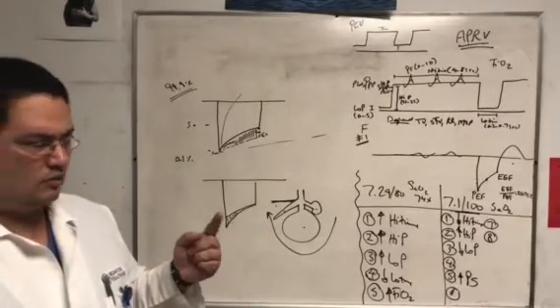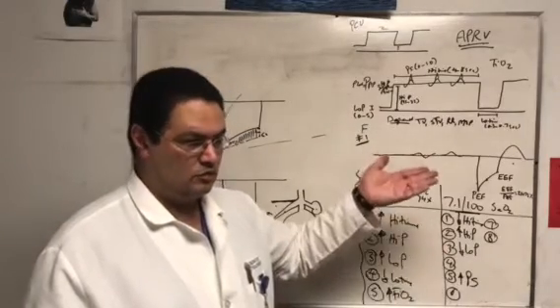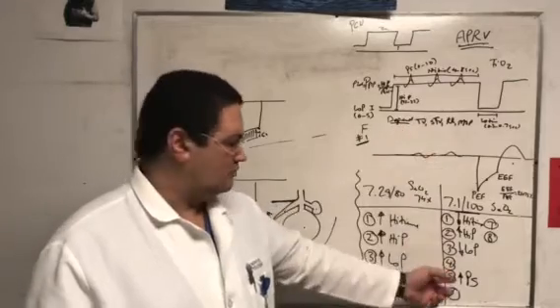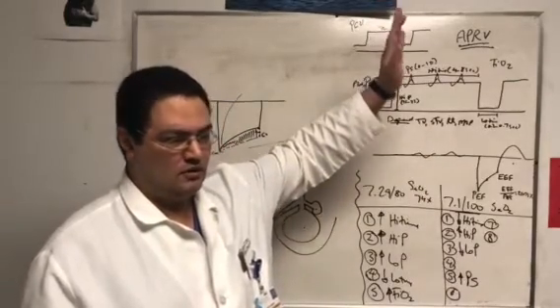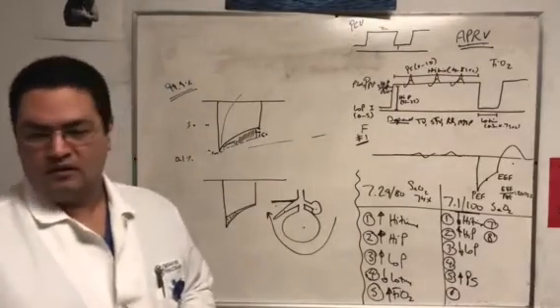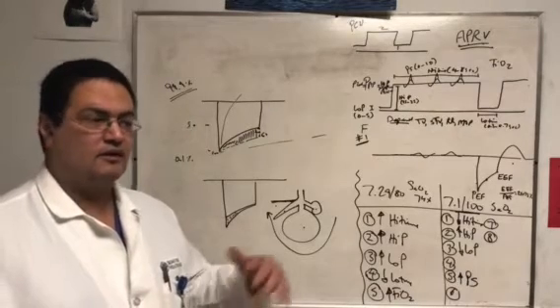For many reasons. Number 1 is that by the time you increase the high pressure, which is the most preferred, right? You go up to 35. If you add more pressure support to it, that'll be above 35. We don't want to go above 35. That number, we don't want to, maybe will injure the lung, although there's debate, right? So that's number 1.